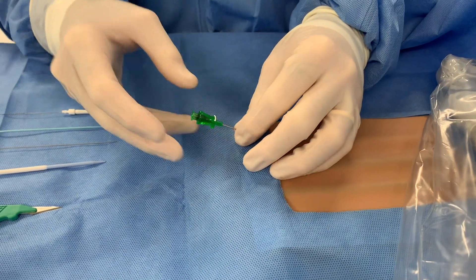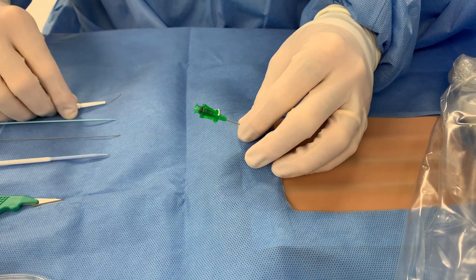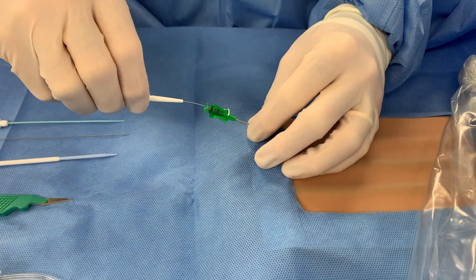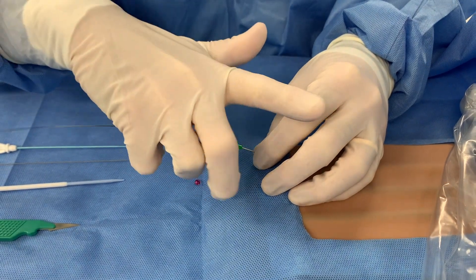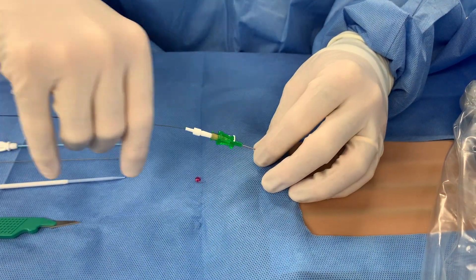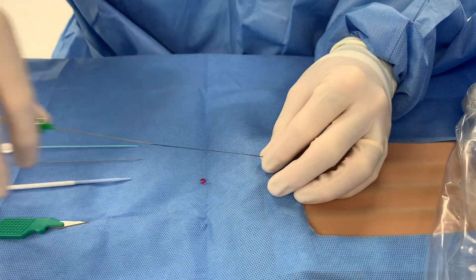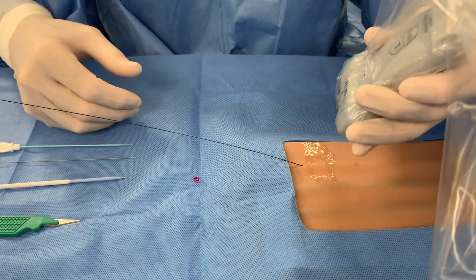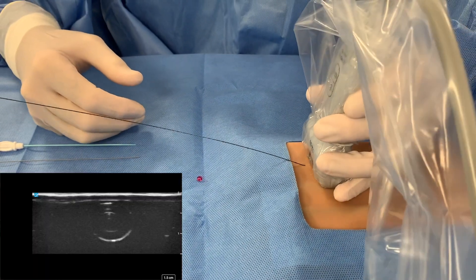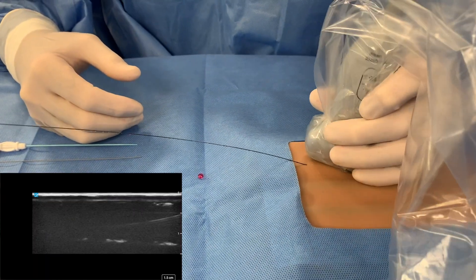Advance the 0.018 inch micropuncture guide wire through the introducer needle and withdraw the introducer needle, leaving the guide wire in place. Confirm with ultrasound that the guide wire is in the target vessel.